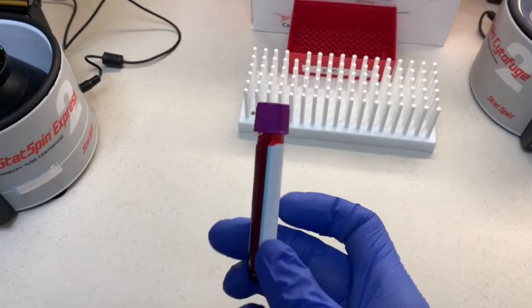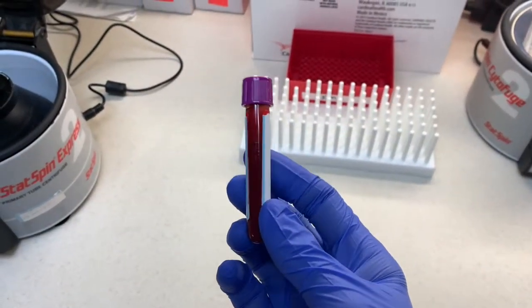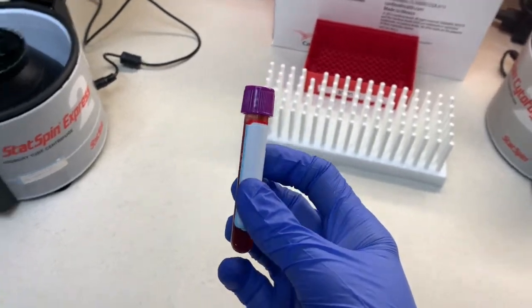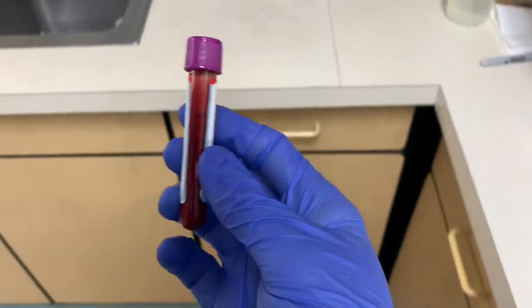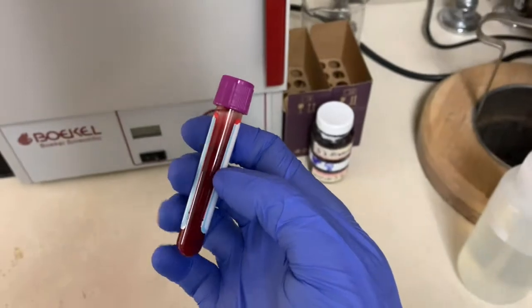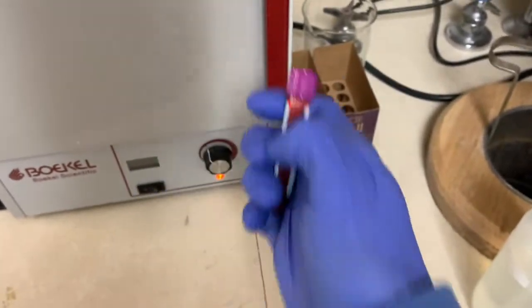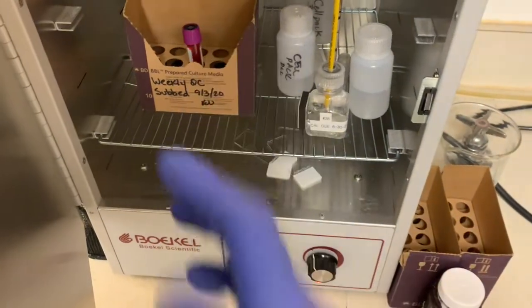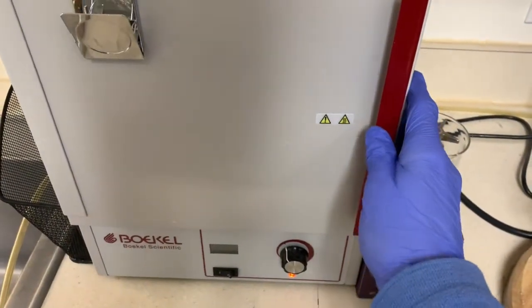Okay, so once you know you have a cold agglutinin sample, the first step will be to incubate it at 37 degrees for about 30 minutes. That will hopefully clear up some of the red cells sticking together and release the antibodies so you can spin them down and be able to remove them. So this is an incubator. Set a timer for 30 minutes.